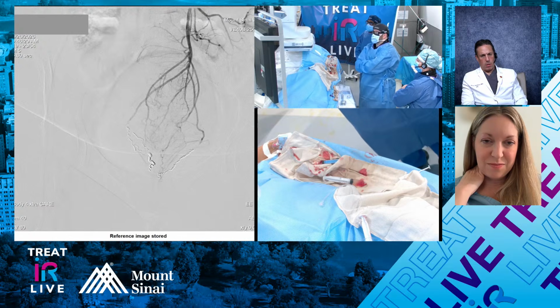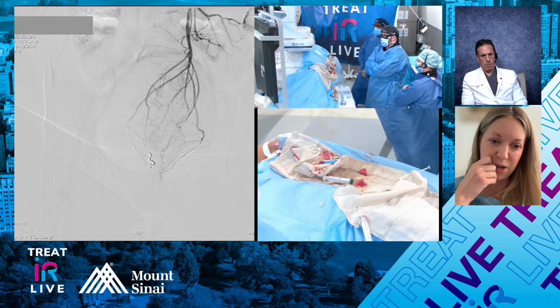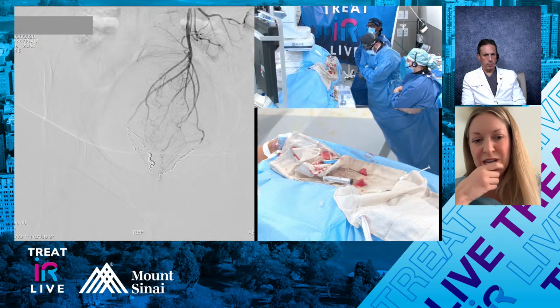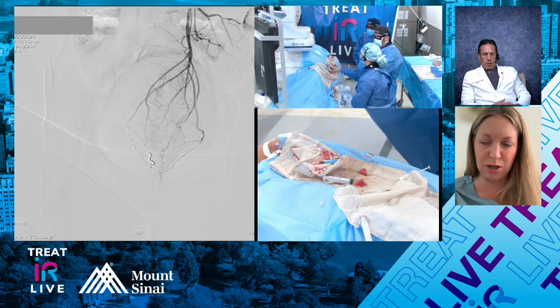Jesse, what do you think of this for an endpoint? I like it. You could, if you wanted to, interrogate that one that you're seeing coming off the left side. But I want to see the initial run. I think you've addressed all major areas of blush here.